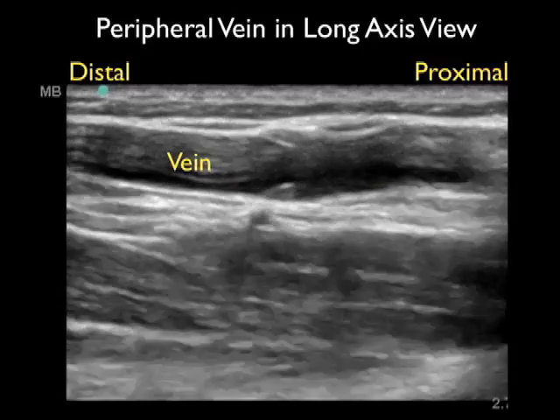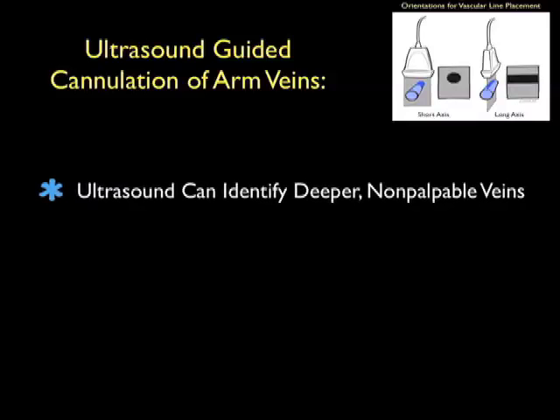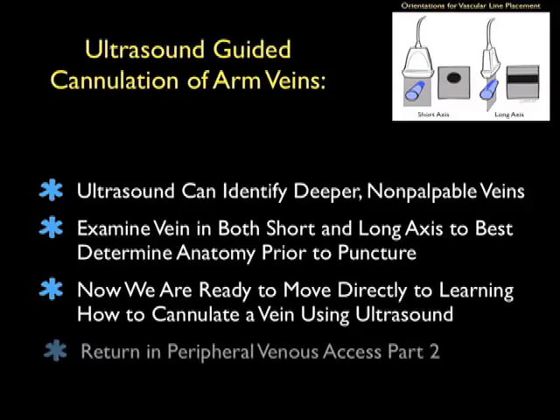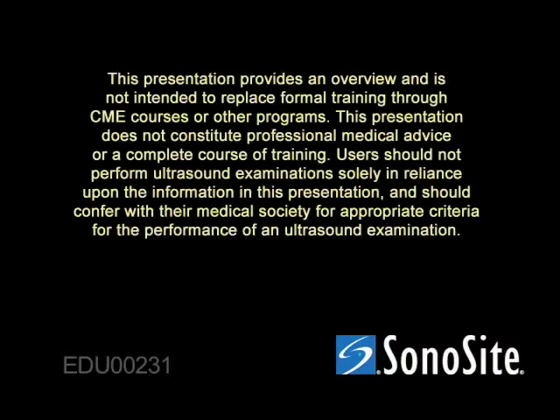Looking in long axis gives complementary information about the vein. Thanks for tuning in to part one of ultrasound-guided peripheral IV insertion. Ultrasound can be very helpful in identifying deeper and non-palpable veins that can still allow placement of an intravenous catheter. We'll be looking at the vein in both short and long axis views to determine the anatomy prior to a puncture attempt. Now that we have a good sense of how to look at a vein in both views, we're ready to move to learning how to cannulate the vein using ultrasound. See you in part two of peripheral venous access.